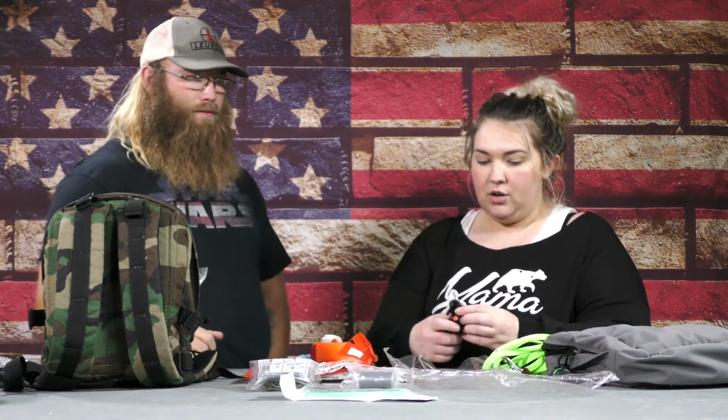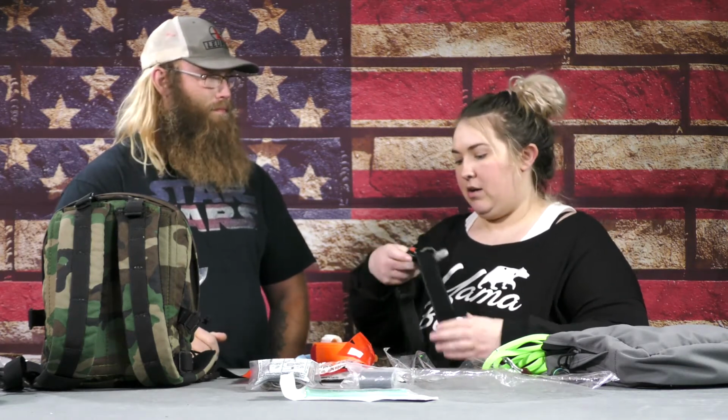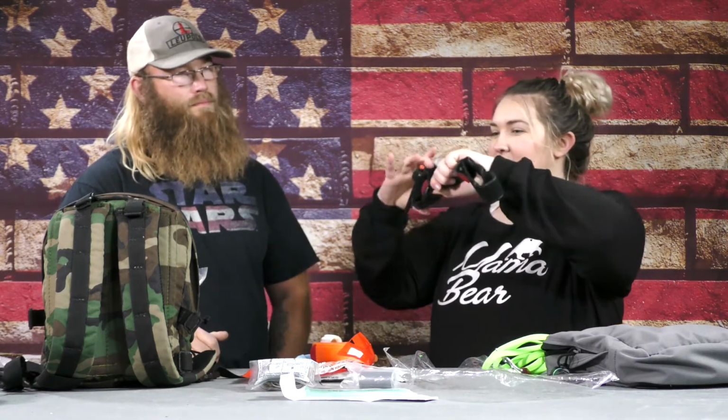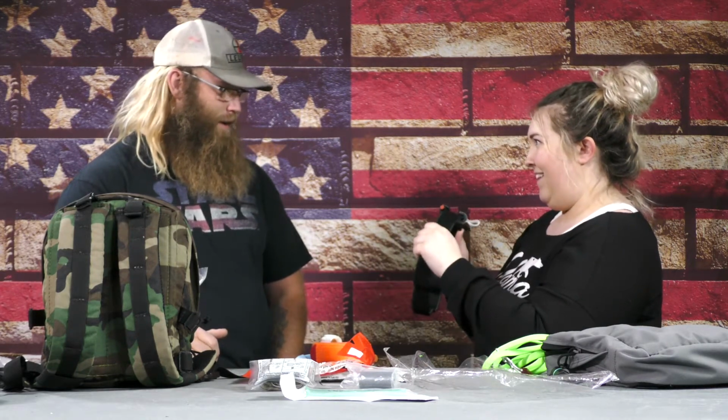All right, so the RATS Tourniquet, TK4. Next is the Recon. The way that these work, and you'll understand what I meant when I say it would bottom out on kids, is it can't get any smaller than that right there. My kid's arm is smaller than that, and that's as tight as you can go. You're limited.